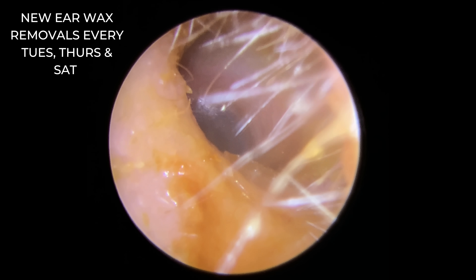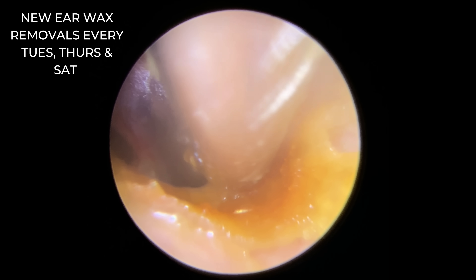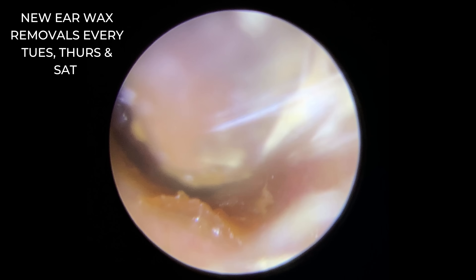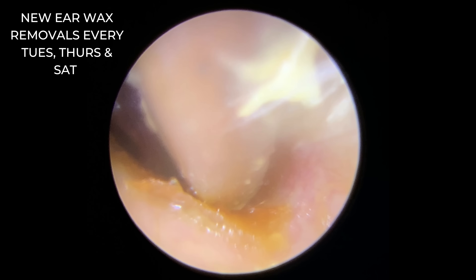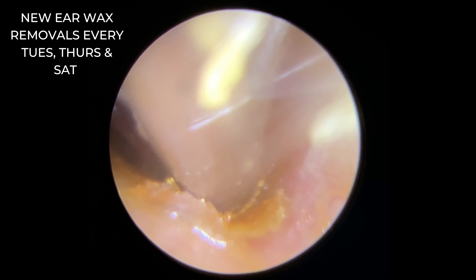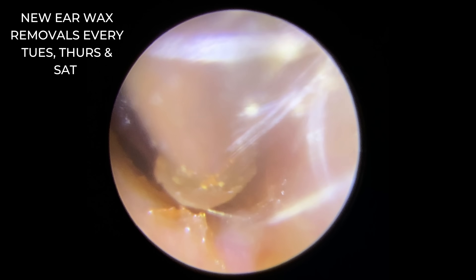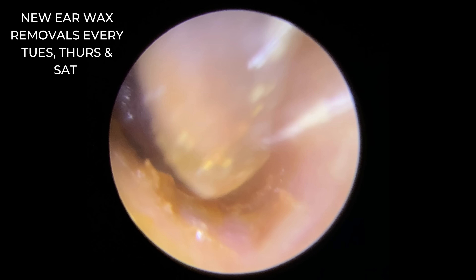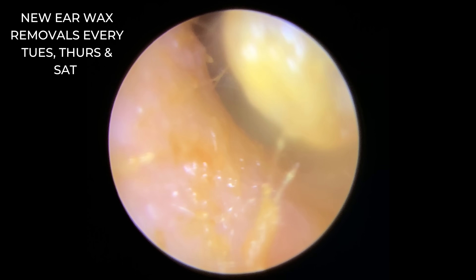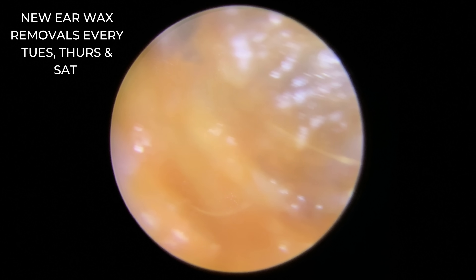So we just get this last little bit out here. Lots of skin around this one — just nipping this last little bit of dry skin. Look how that is peeling away. I'm just dropping over the top and peeling backwards. The reason I'm doing that rather than peeling upwards is because this would peel all the way down to the eardrum, and then we're at the risk of bleeding and getting into a really awkward position. So I'm just clipping this off above the skin. It's all come away.